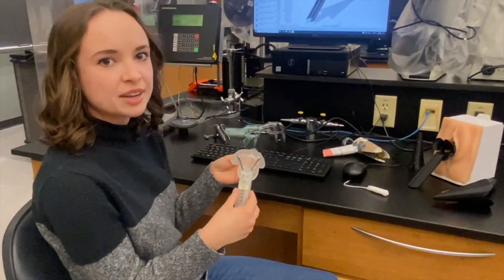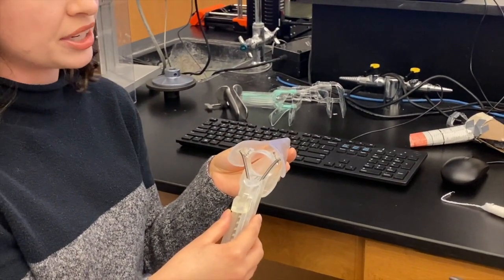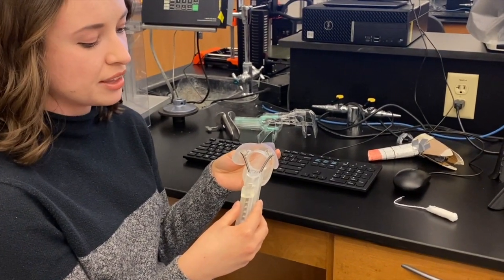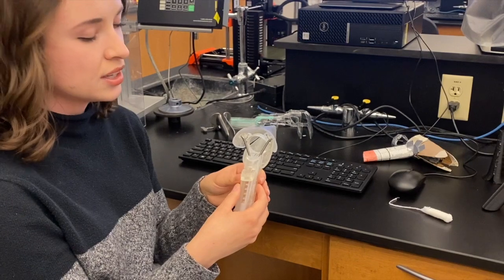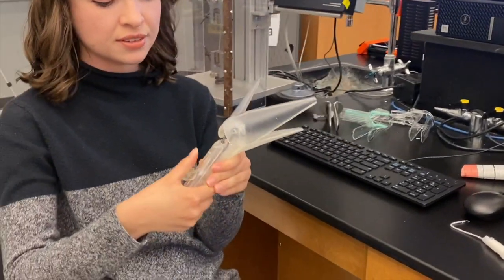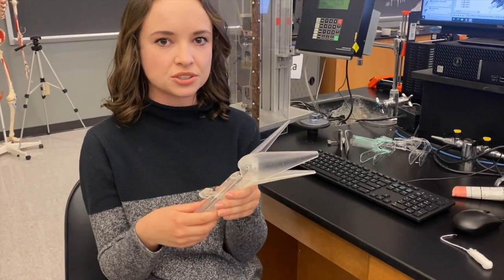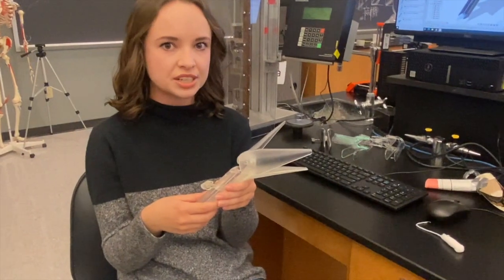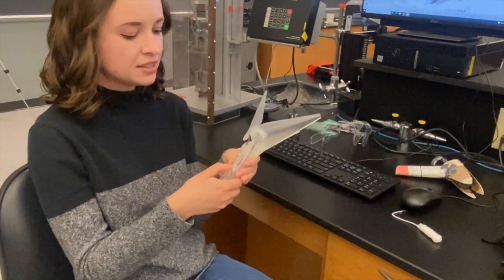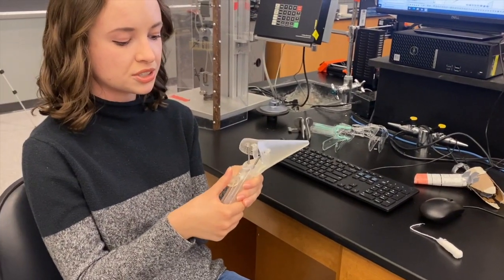The speculum features a brand new opening mechanism, which is different from all others currently on the market. The opening mechanism consists of two springs and a thumbtab lever. To open the speculum, pull down on the trigger — this expands the upper two blades, which expands the vaginal walls and allows for clear visualization of the cervix. To close the speculum, simply pull the tab towards you and return the thumb trigger to its initial position.